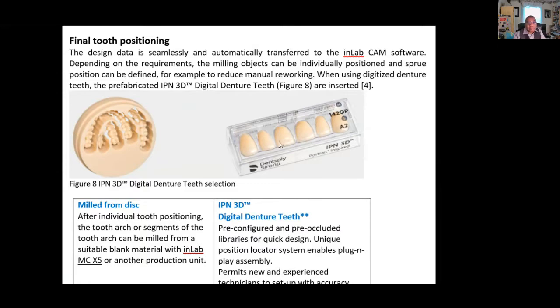Like I said, you do not 3D print the teeth, you just select off the shelf. The simple reason is that, as far as I know, the state of research is that there is no... Dr. John may want to come in here. I do not know of any 3D printed teeth that compares with zirconia. That is still in the lab stage. I've read that some work is being done, but I do not know whether it has been FDA approved. If it is not FDA approved and not Health Canada approved, we cannot use those teeth. So for now, this is what we are using.